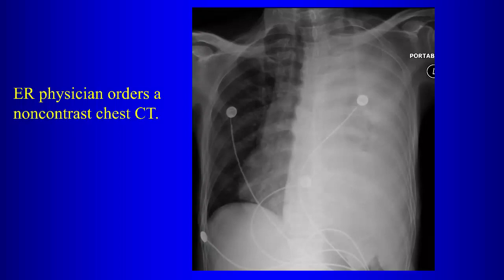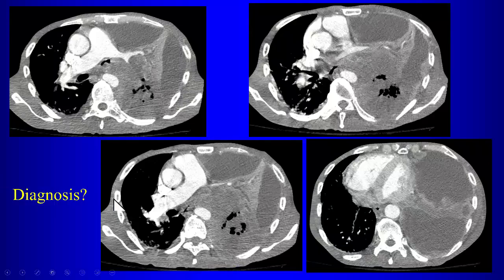Yeah, so with large pleural effusions, the two major things that you think about in terms of differential diagnosis, one is empyema. What else? Underlying mass. Malignancy, right? Hepatic hydrothorax can also present as a large pleural effusion, but there you have some history of liver disease. So if you're trying to diagnose malignancy or empyema, those are cases where contrast is very helpful. Again, the larger the abnormality on the chest radiograph, the more you're going to need contrast to figure things out. And so here's the CT on this case.